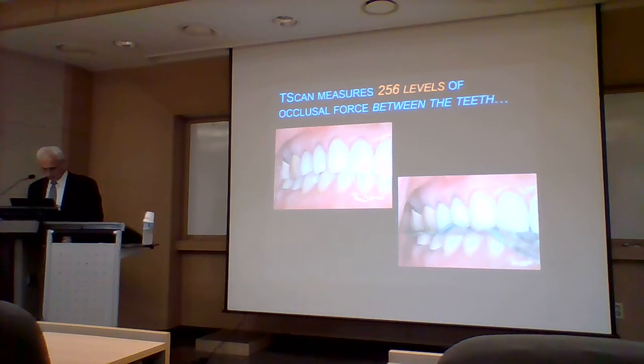Until it was developed in 1984, there was no way to measure between the teeth. No way to measure forces, no way to measure time.